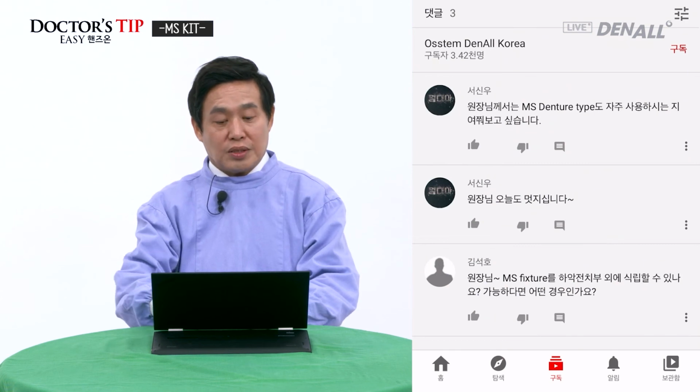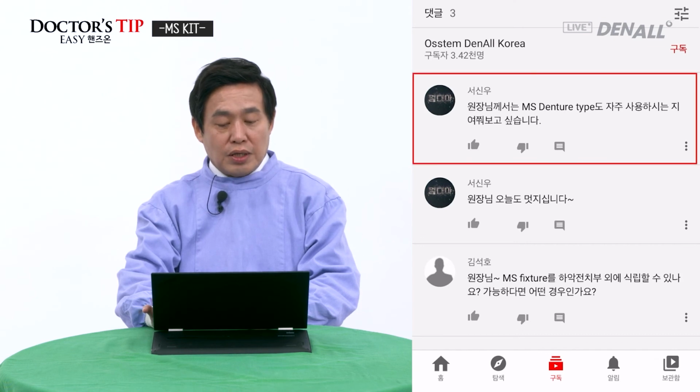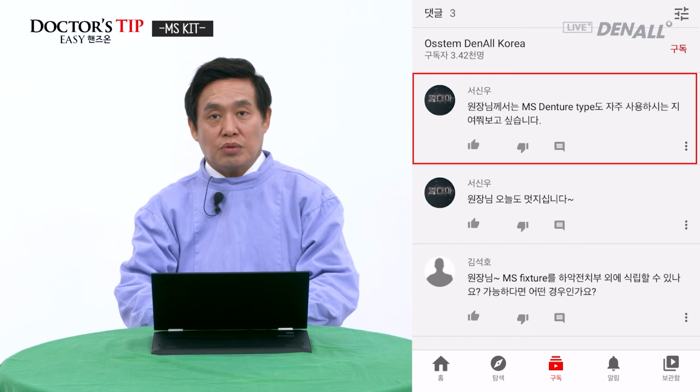So let's answer some of the questions related to the MS kit. Dr. Shinuseo says, do you frequently use MS denture type? I do believe I told you in the lecture. In the case of MS implant denture type, it is used in overdenture with O-ring connection. But recently locator and other connections are readily available. So recently O-ring type overdenture is not used as much as in the past.